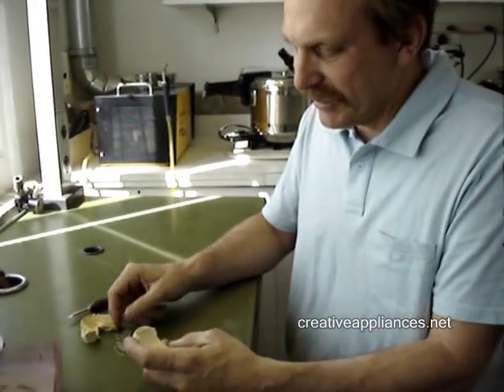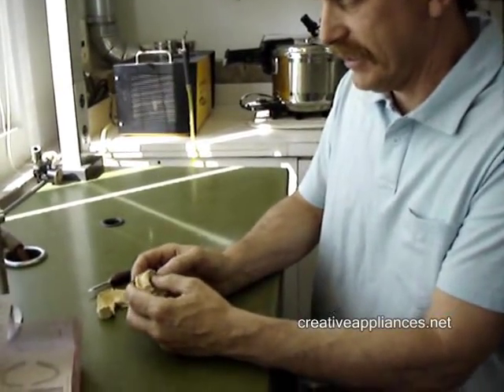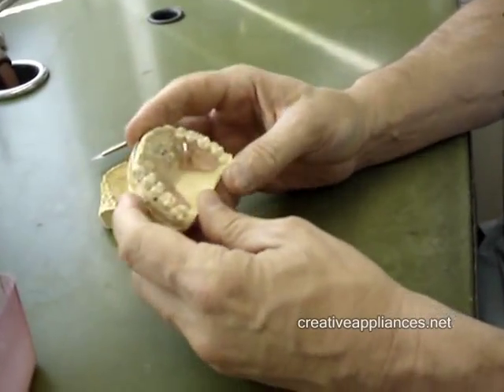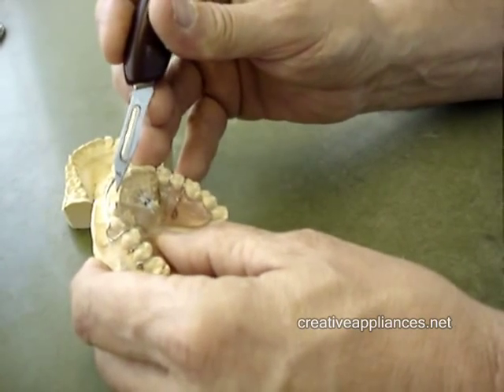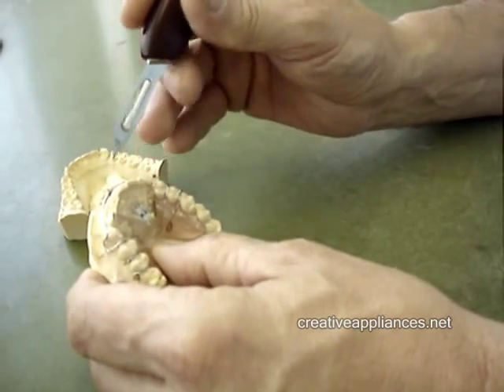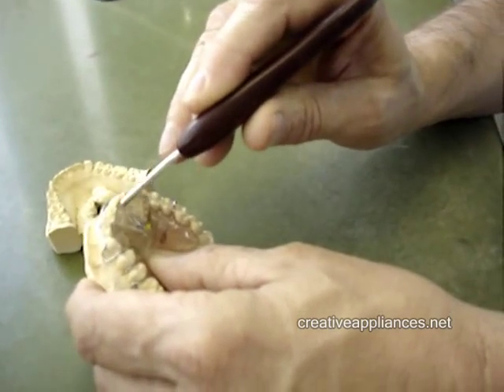Today we have the finished appliance for the smile that she's always wanted, and as you can see it fits on the model like so. As mentioned in the first video, we have the expansion screw focused on the three anterior teeth — two centrals and one lateral — that will eventually be pushed into the bow, which is bent to the perfect arch form.